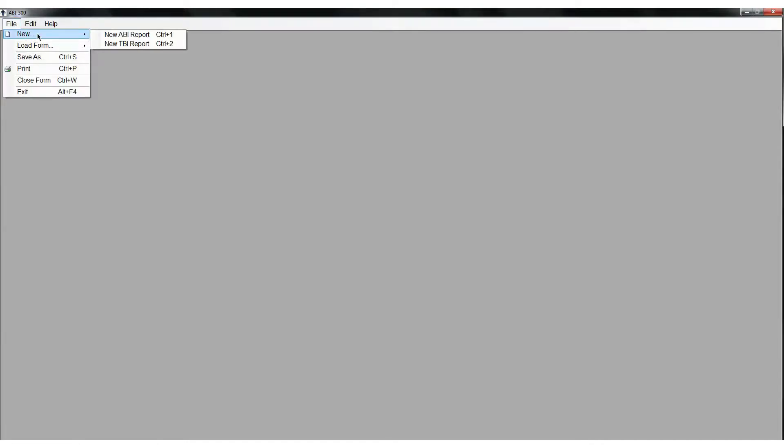On the computer desktop screen, select the simple ABI icon. When the screen opens, click the File tab, then New, and select ABI Report.